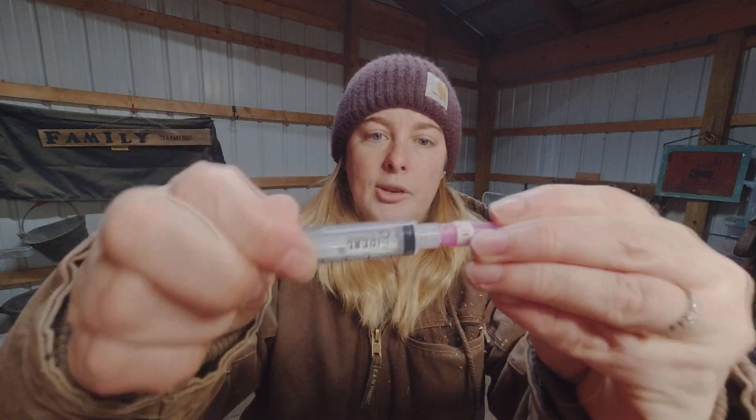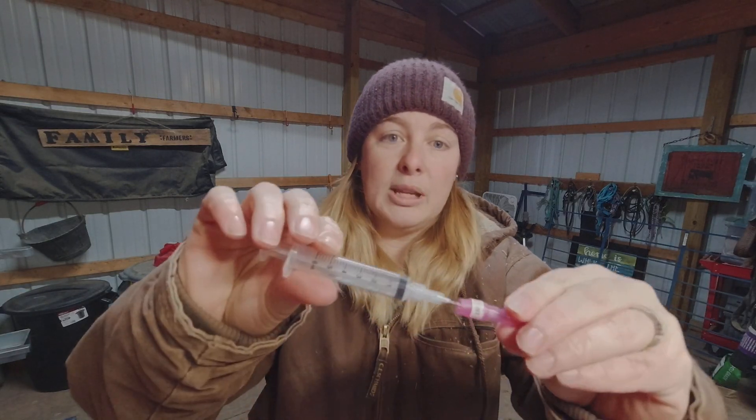For drawing blood, I really like to use a 6cc syringe paired with a 20-gauge needle, with luer lock fittings on top — you just twist, it's nice and easy to resheath and safe to carry around. It's really important that you don't reuse needles or syringes, as you don't want trace amounts of one goat's blood in another's sample. If you're drawing blood from five different goats, make sure you have five different needles and five different syringes.